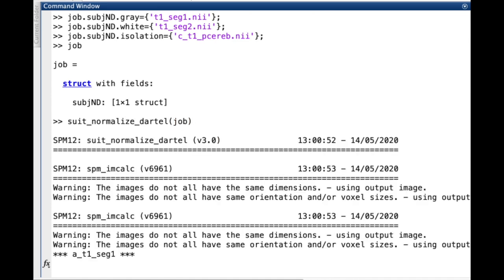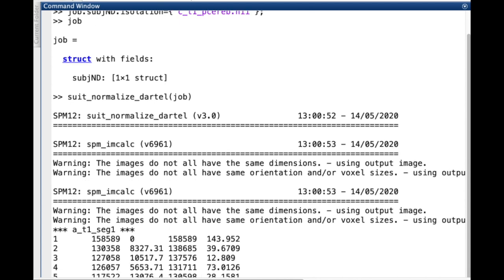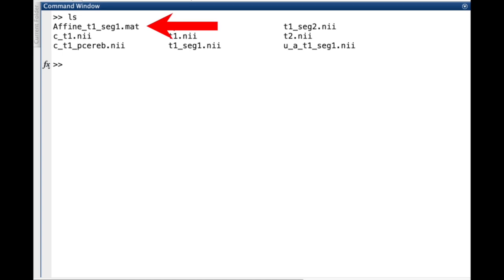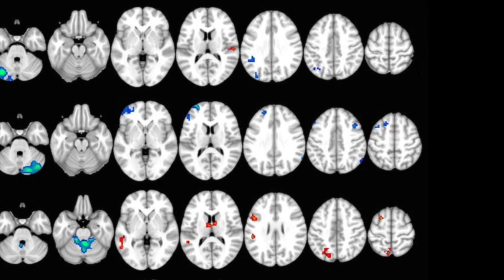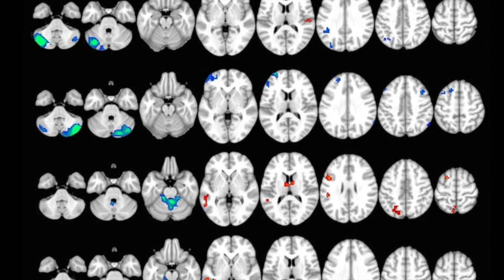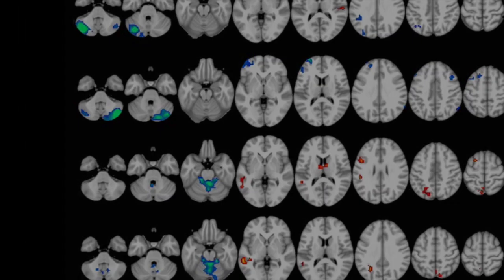Close and press enter. The function will take a couple of minutes and will produce two files, one containing the affine transformation and the second with the deformation field. As I mentioned before, from this point forward, you can use different functions depending on your scientific question. Let's imagine that you run an fMRI experiment and you have first-level BOLD activation maps for each subject, and you would like to perform a t-test between groups or even a simple group average.